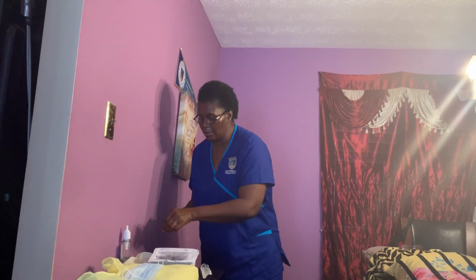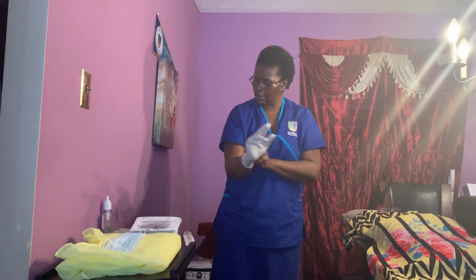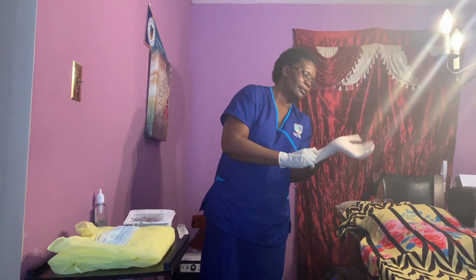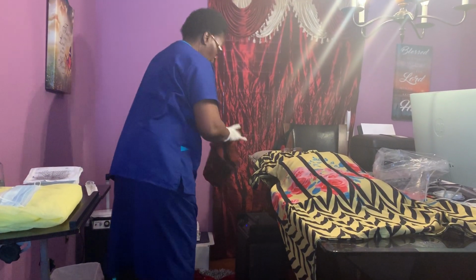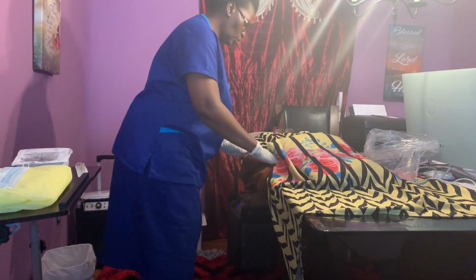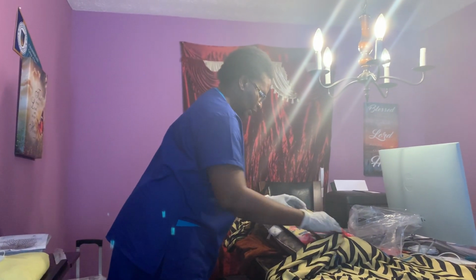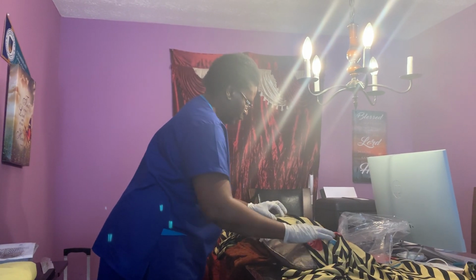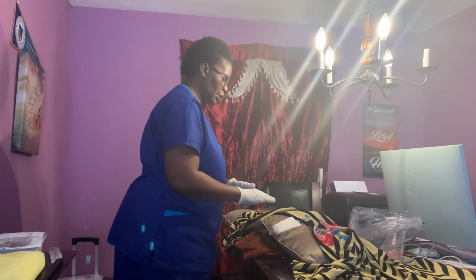and then I'm gonna don my clean gloves. So I'm donning my clean gloves, and then I'm gonna put my absorbent pad underneath. So this is the absorbent pad I'm gonna use. Put the absorbent pad underneath the wound where I'm gonna do the wound dressing. Then I'm gonna expose the site. So now that I've exposed the site of the wound, I keep the patient covered and do not expose the patient, just the side that I'm gonna take care of.